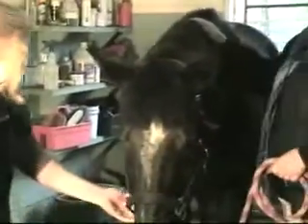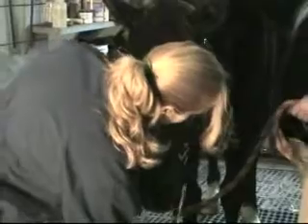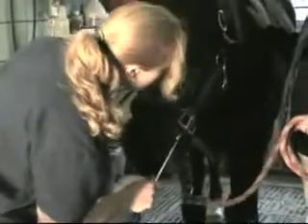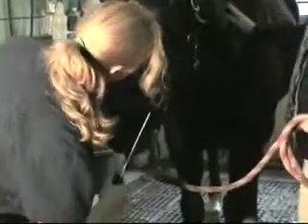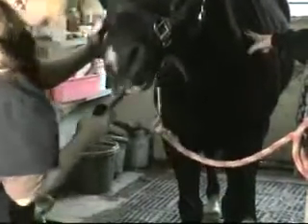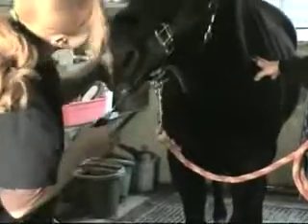And you can see he's getting a little sleepy now. Yeah, his head's dropping, isn't it? Soon he'll be on the floor. He'll be licking concrete. I was going to wake him up. See, he's still awake enough to wiggle his mouth a little bit there.